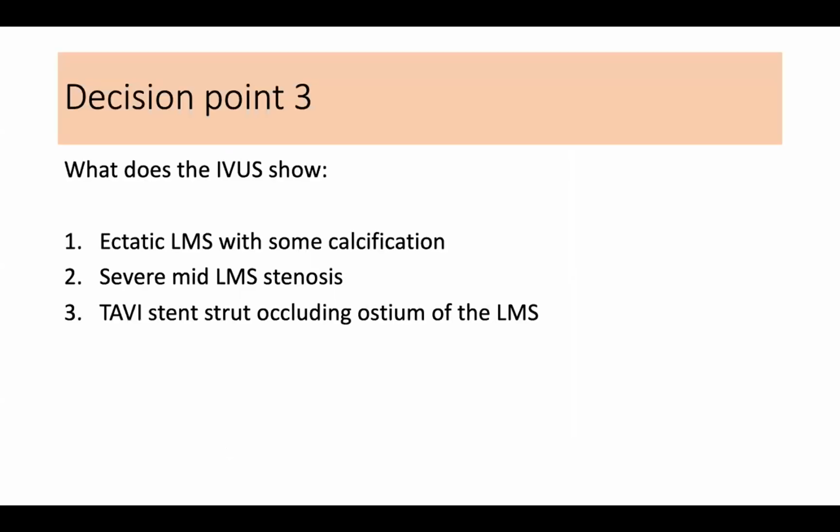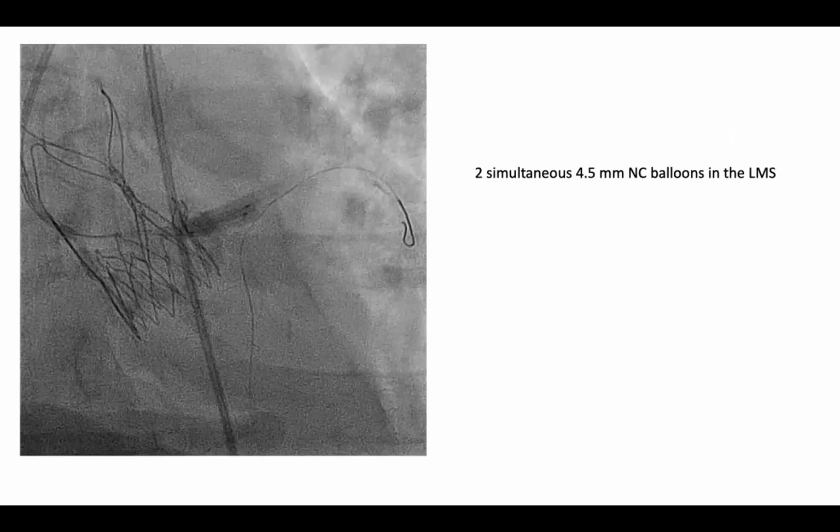Okay, all right, so let's carry on. I'm just going to move on. Now, I'm sure that most of you would have seen that the distal and the proximal left main was huge. And when I say huge, the diameter of the distal left main in some frames was as high as 10 to 11 millimeters with a MLA of more than 20 millimeters square.